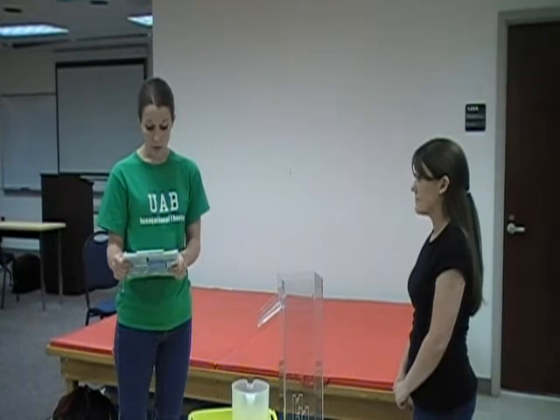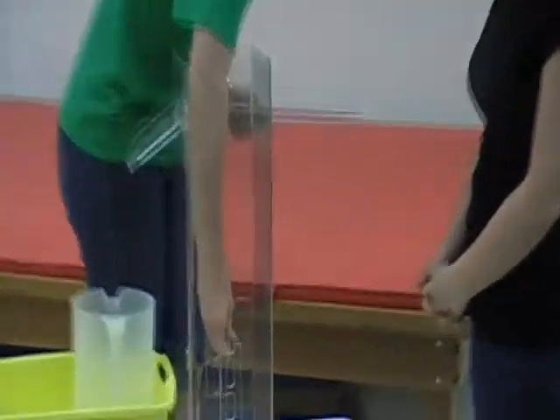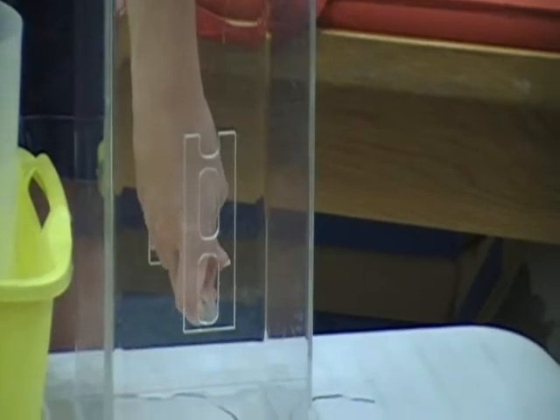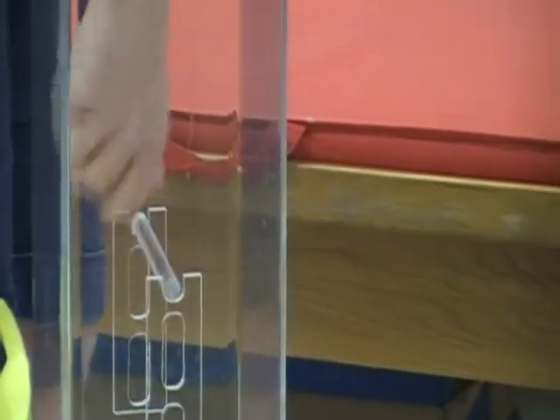First, you want your client to remove all jewelry or other objects from their extremities. This little bar goes into the volumeter, and where you put it depends on how long your client's arm is. If you had a client with a really long arm, you would put it on the bottom, whereas with our client here, she has a short arm, so we put it on the top.